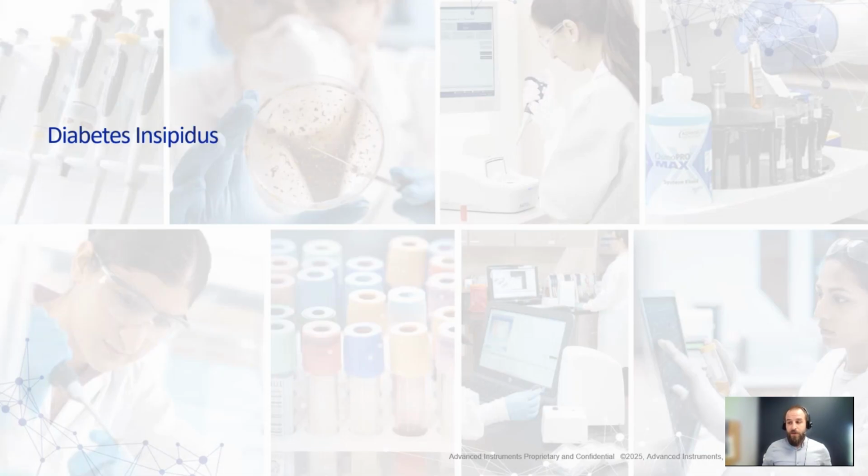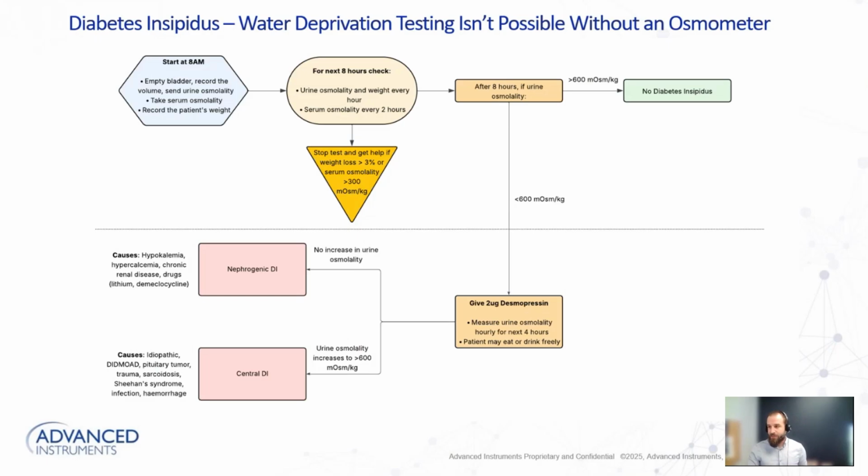All right. So the next example that we're going to use as part of this webinar today is diabetes insipidus. So diabetes insipidus is a water clearance disorder. It's a disorder that presents itself with the inability to concentrate urine, more or less. So how we're actually going to identify if a patient has the inability to concentrate urine is we're basically going to put them through what's called a water deprivation test. And it simply isn't possible without an osmometer. And I'm going to explain to you why in just a few seconds.